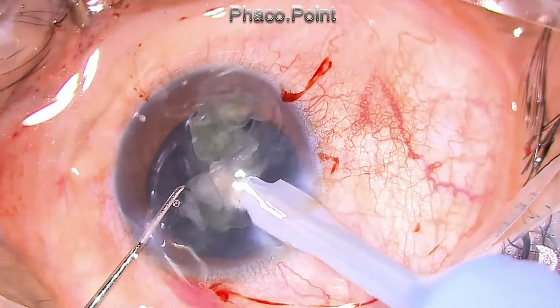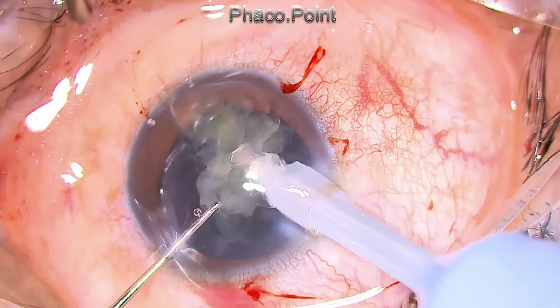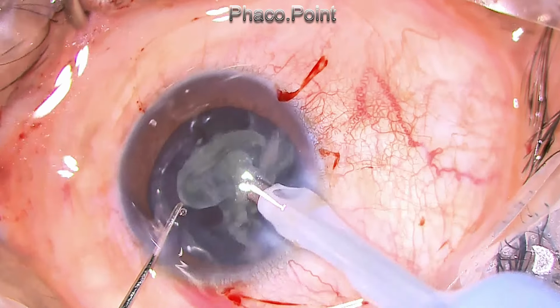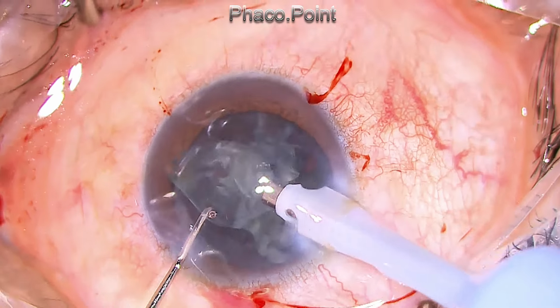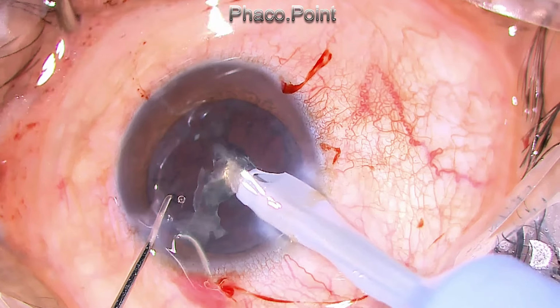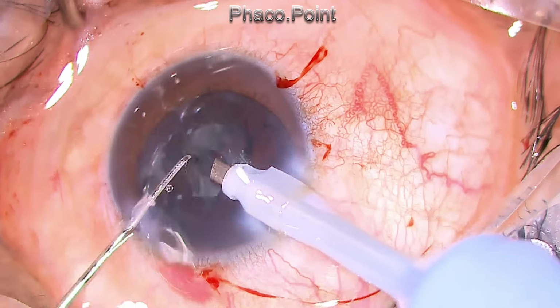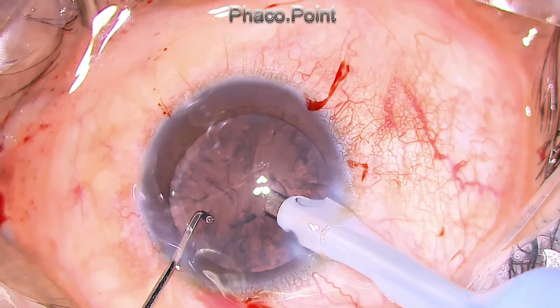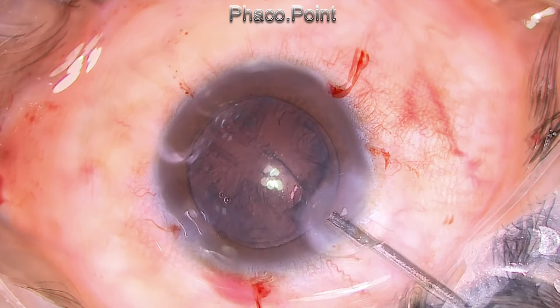Now this is what I'm saying: if you had not put in the capsular tension ring while attempting to remove the nucleus fragment, the unsupported equator will flop in, and then there is a very high chance that you can catch the floppy equator of the bag and create a punch hole through the equator. Simply supporting the edge of the capsular rhexis using an iris hook or a capsular hook will not work.